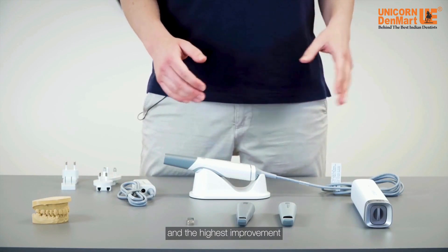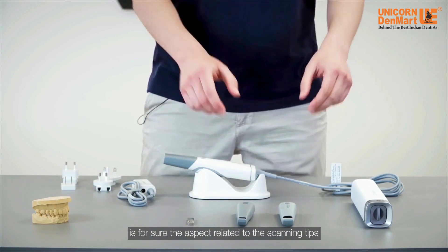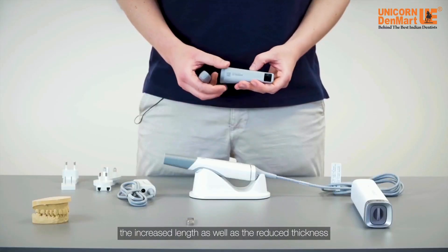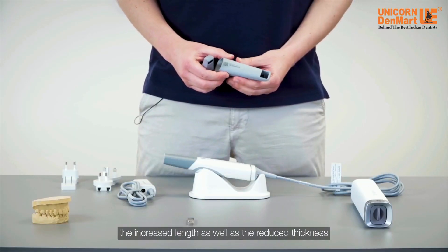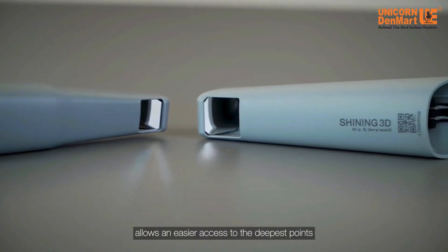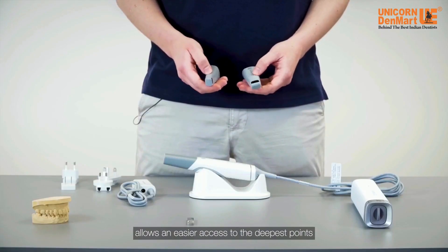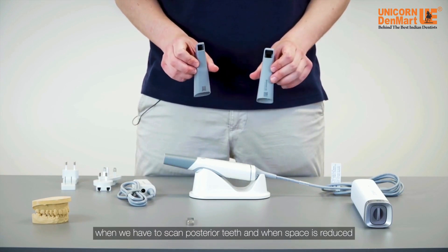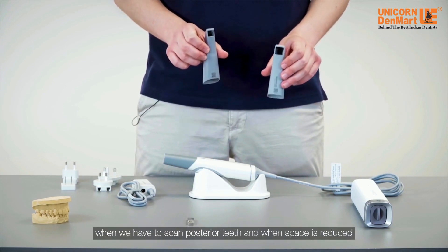One of the aspects for which we can see the most important news and the highest improvement is for sure the aspect related to the scanning tips. First of all, the increased length as well as the reduced thickness of the tip allows an easier access to the deepest points of the patient's mouth, which is a very useful feature when we have to scan posterior teeth and when space is reduced.